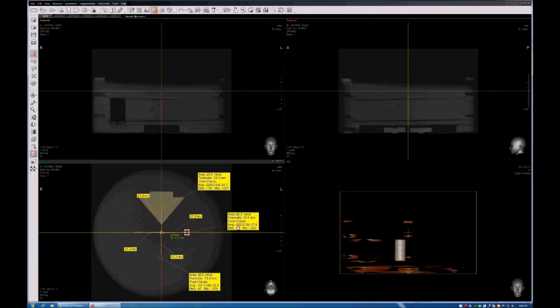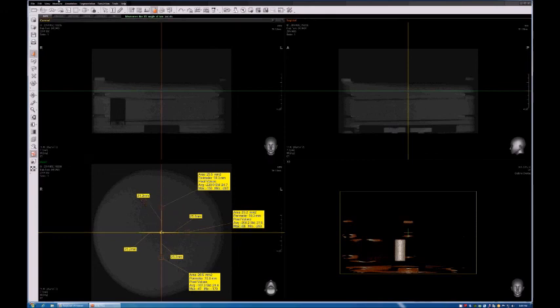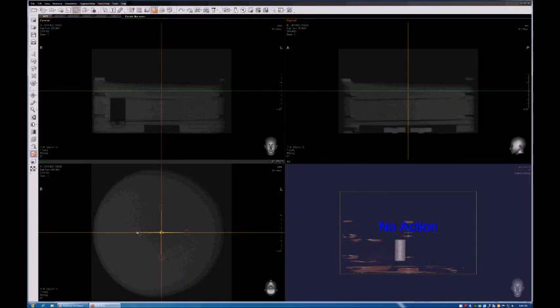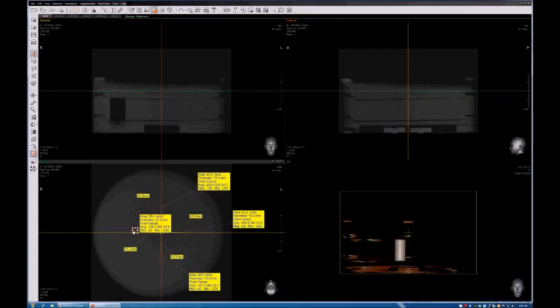And after you finish drawing those regions of interest of yours, just don't forget to save your screenshot for your own records. That's it. That finishes the daily inspection process.